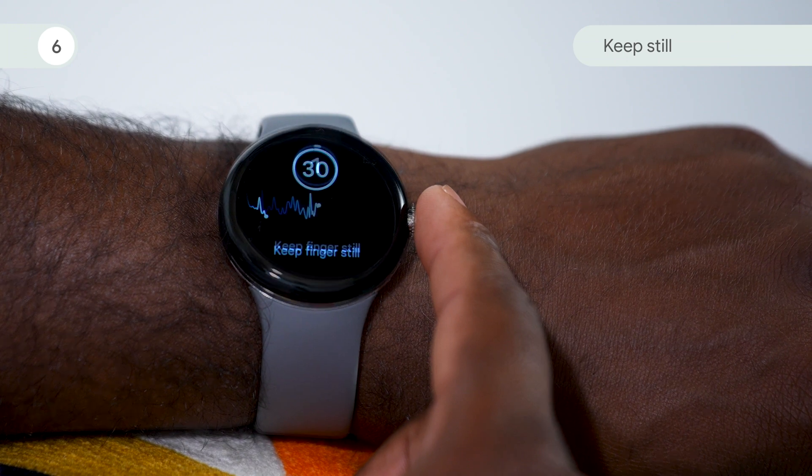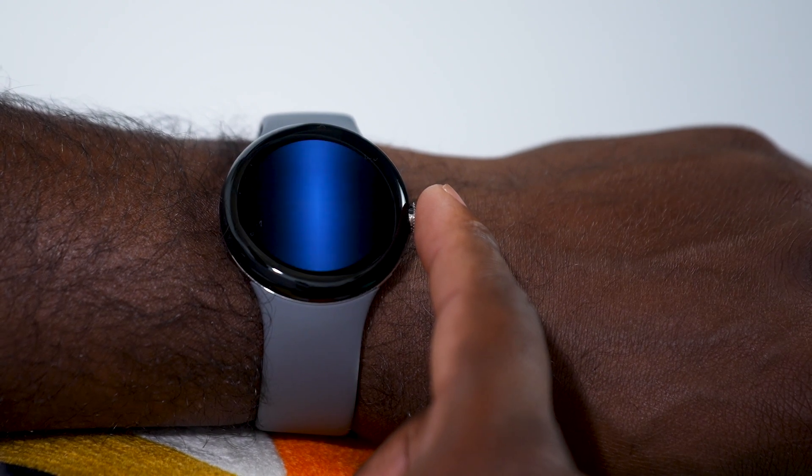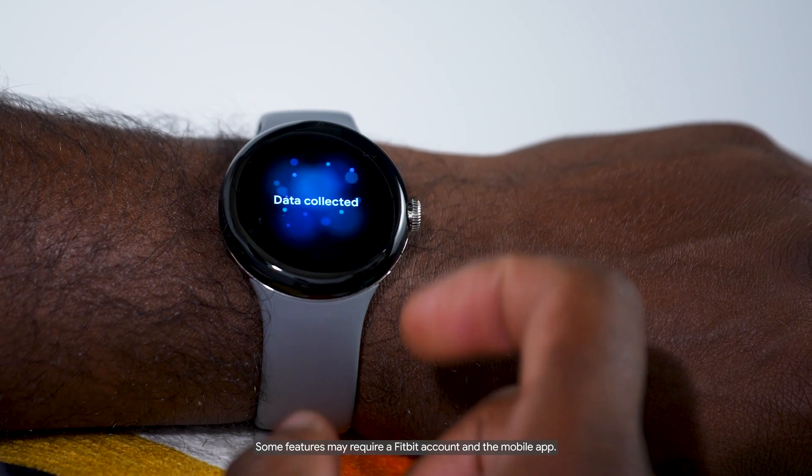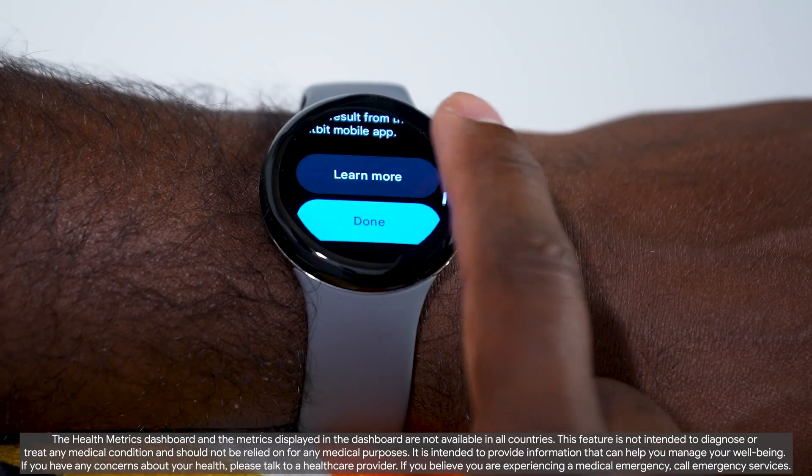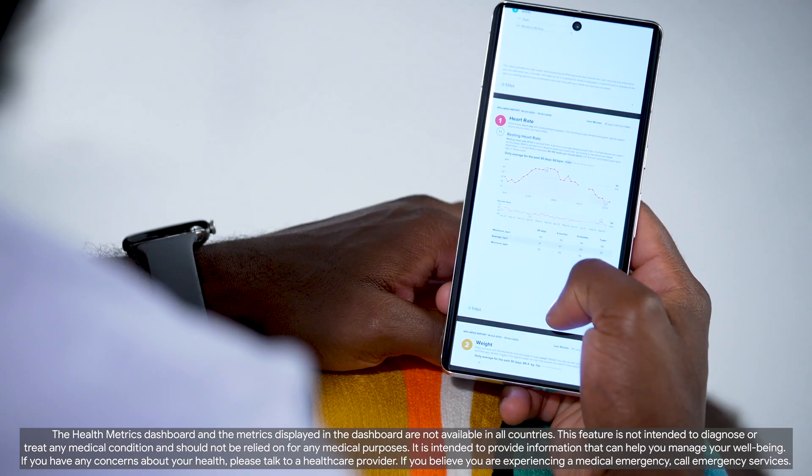Keep still during the countdown. When it's finished, remove your finger. Your results will display on your watch. Tap learn more to get more information on the Fitbit app on your phone. To share your results with your doctor, tap export a PDF for your provider.